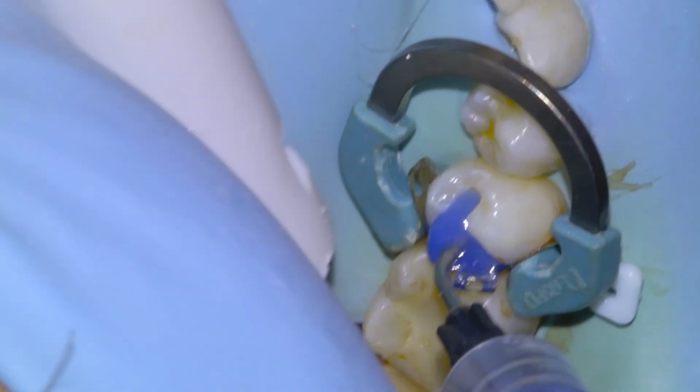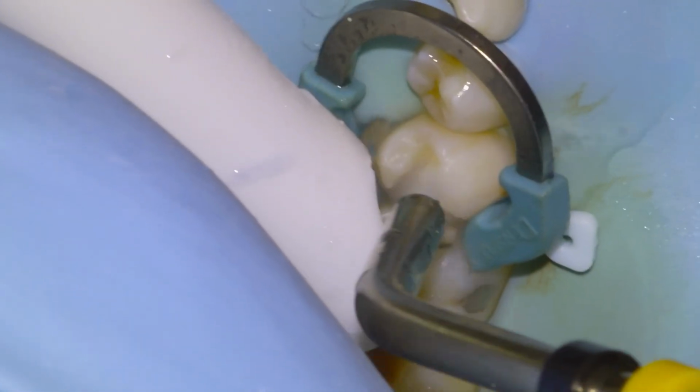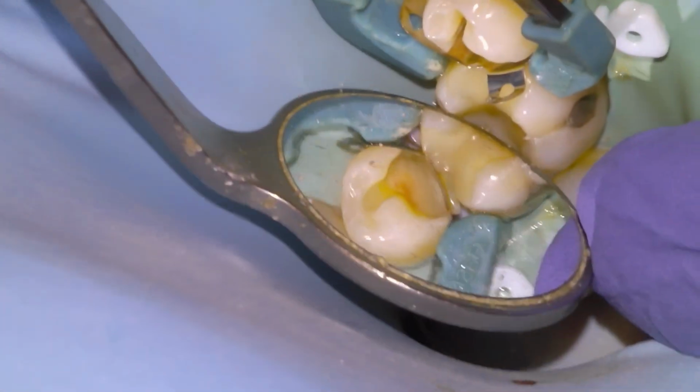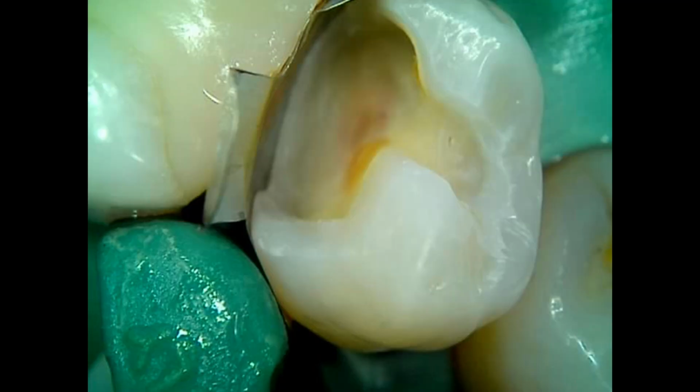So we'll dry the tooth, apply our 5-second phosphoric acid etch. Lots of people ask questions about why do you etch for glass ionomers or glass hybrids. And I do it because it works and it's faster. Lots of papers showing that 5-second phosphoric acid etch is equivalent in shear bond strength to 15-second polyacrylic acid scrub. Gonna mostly dry it, and then there's the surface treated, ready to restore.